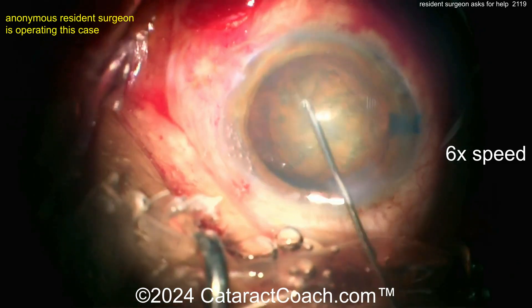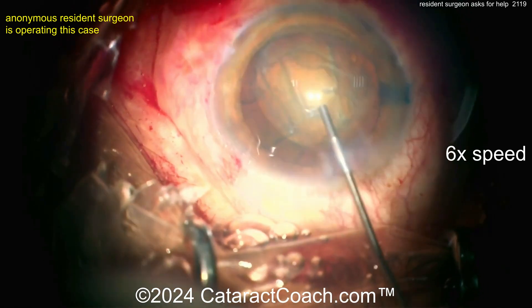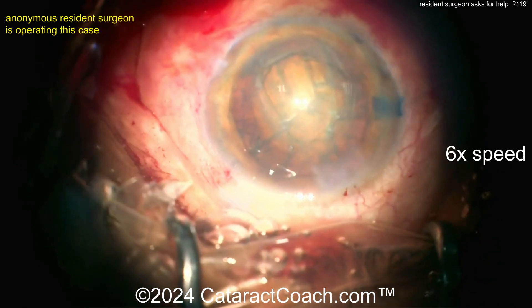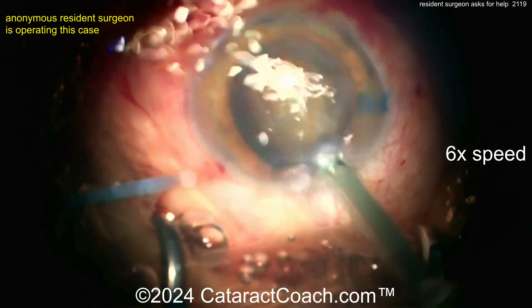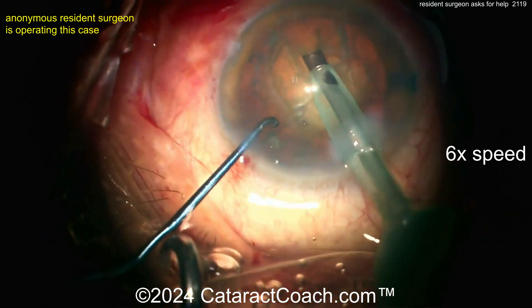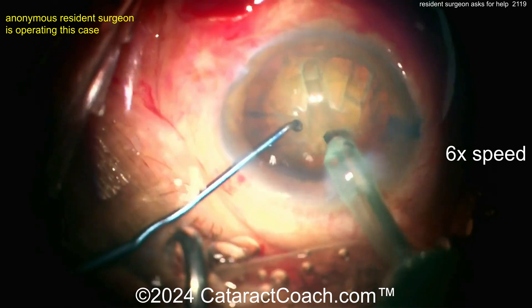But it did rotate — I'll give you that. There's a little bit more hydrodissection, and now let's see what we're going to do with a little more viscoelastic. Let's see what we can do with the phacoprobe. The incision's not terrible but I'm still not a fan — we'll look at the end and see how it looks. Now here we go with the phacoprobe.